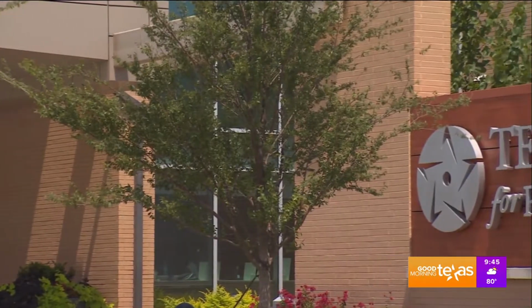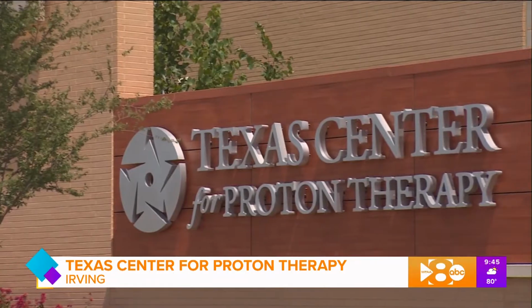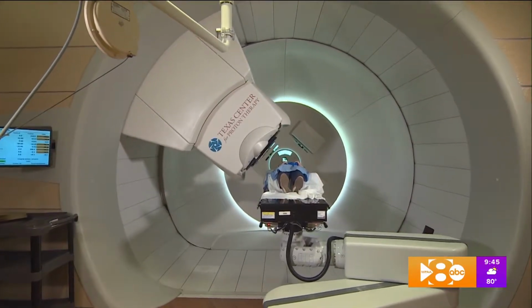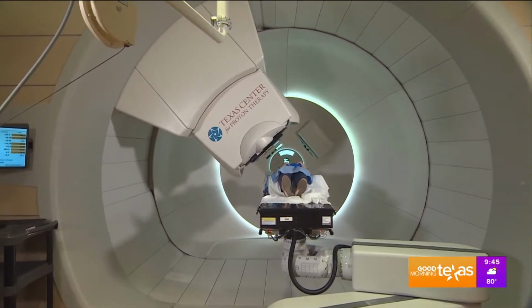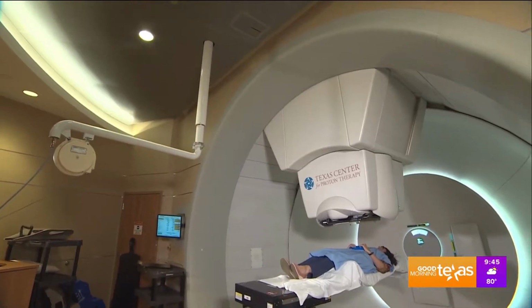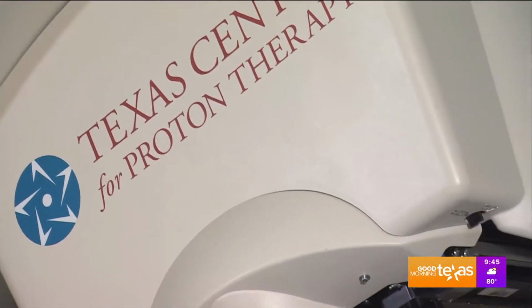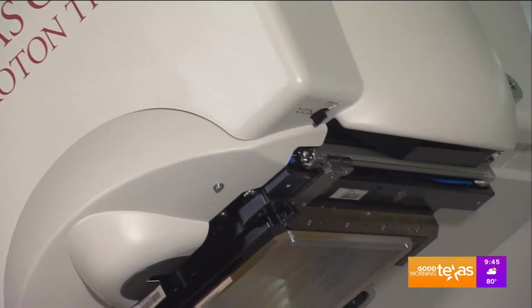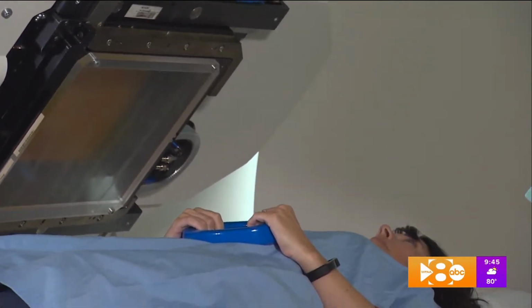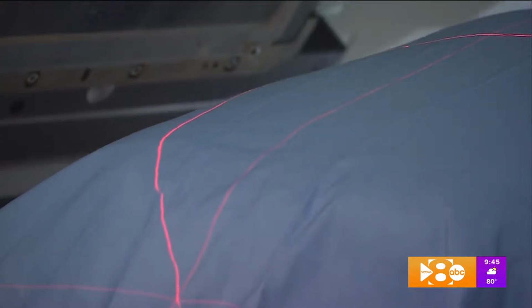Well, what is proton therapy, and why is it a good choice for treating prostate cancer? Proton therapy is a type of external beam radiation that uses small subatomic particles accelerated to very high speeds to target cancer cells. And for prostate cancer, it can give a very high dose to the prostate, but minimize exposure to the surrounding tissues, such as the bladder and the rectum. And thereby we can achieve high cure rates, but at the same time minimize the side effect profile for patients, and that therefore they can preserve their quality of life not only during their treatment, but afterwards as well.